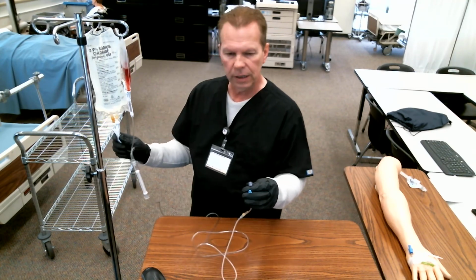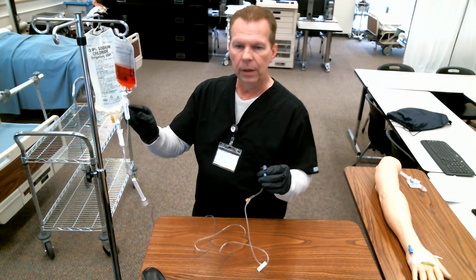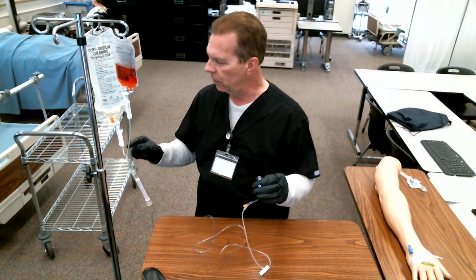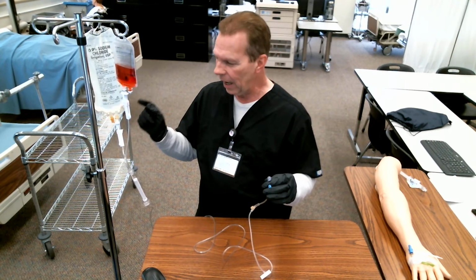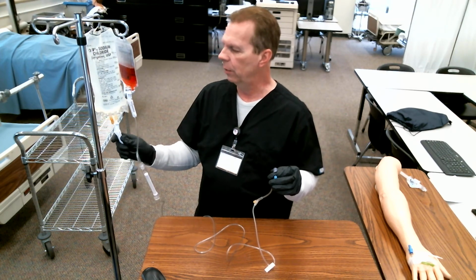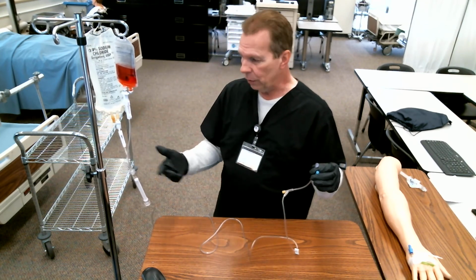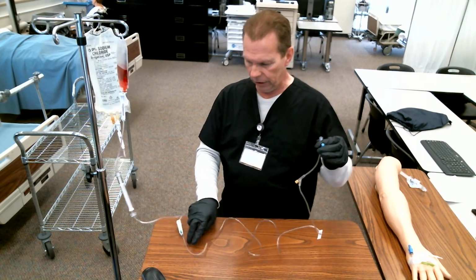Now, interesting thing, pay attention to this. Only one of these can be open at a time. If you open both of them at the same time, the blood will usually run down and then get sucked right back up into your saline bag, and you don't want that to happen. So keep one clamp closed while the other one is open. So they're both closed right now. I'm going to go ahead and open my saline. Now nothing's running yet because the primary regulator down here is closed off too, so nothing's running.